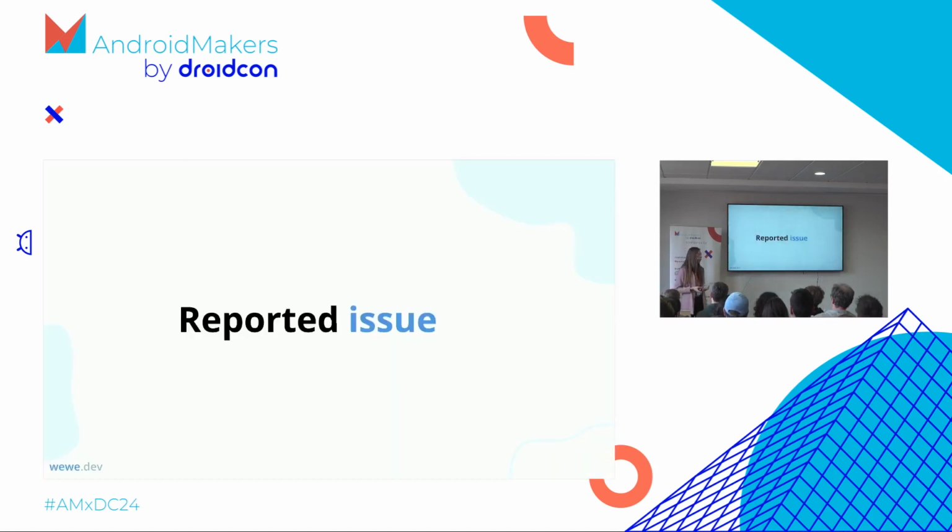Our reported issue was that when users started recording the sound from the lungs, the progress was being reset over and over again. And the user wasn't able to perform one-point recording. When we want to auscultate our lungs and we are talking about monitoring our health, we need to record 1 or 2 points at the front and 6 or more points at the back. And for some reason, some users couldn't do that.